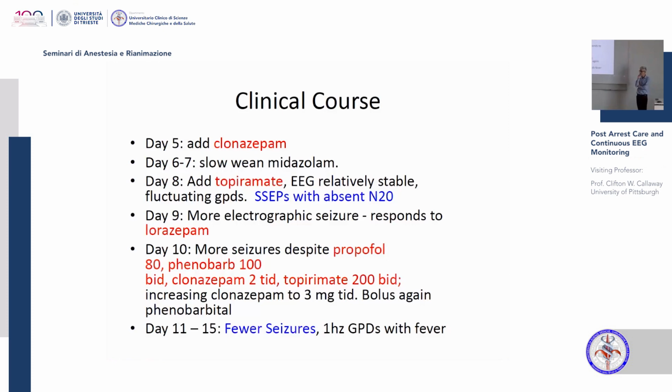Thomas from the audience is asking if the patient was reacting. Sometimes with stimulation, we would see reactivity on the EEG. It's difficult to document with this high degree of anesthesia, but particularly when we did evoked potentials with electrical stimulation, you could see changes in the EEG. In the third week, the seizures start to come down. It's a long time.